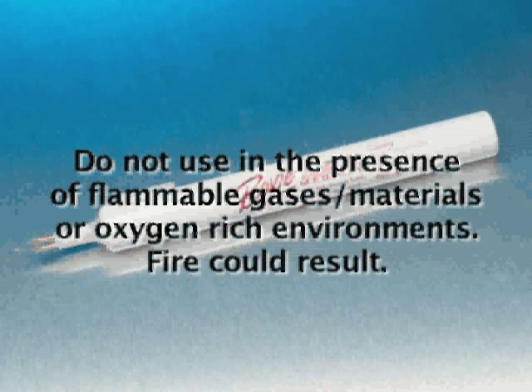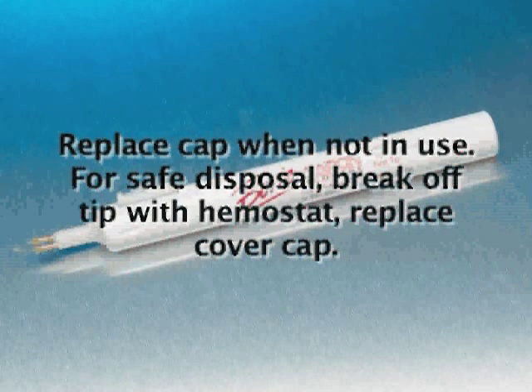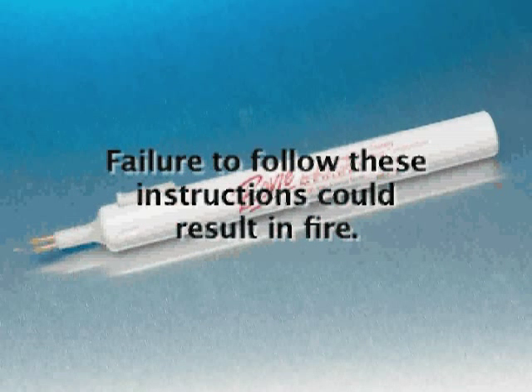Do not use in the presence of flammable gases, materials, or oxygen-rich environments. Fire could result. Replace cap when not in use. For safe disposal, break off tip with hemostat. Replace cover cap. Failure to follow these instructions could result in fire.